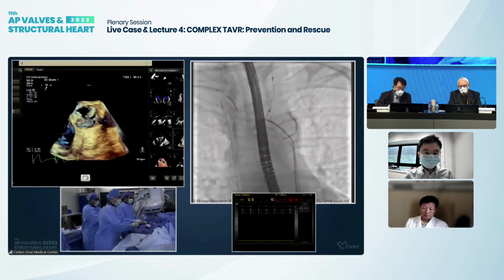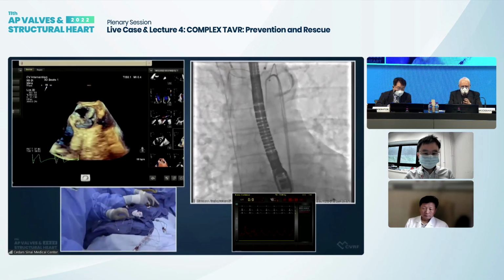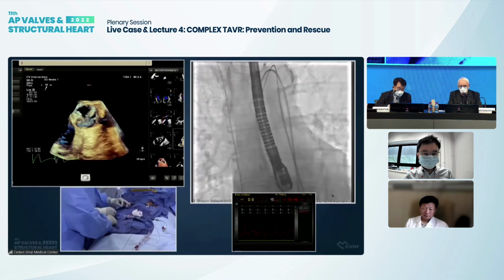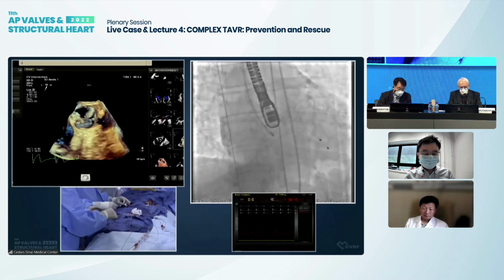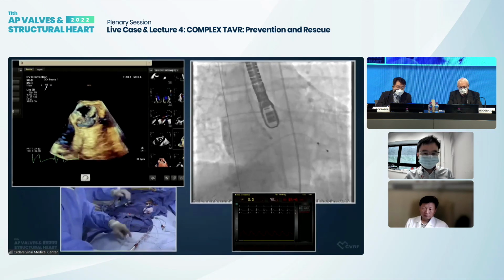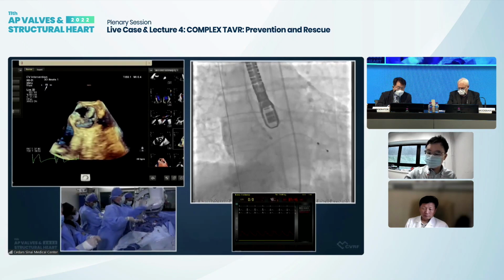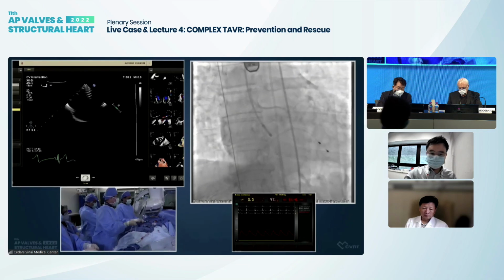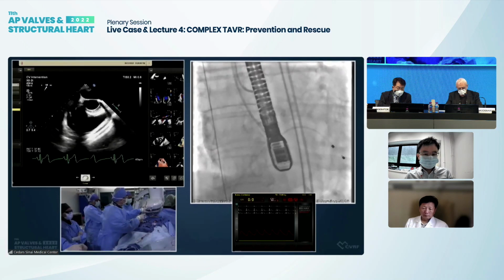Yeah. We had a nice lecture yesterday from David, and as you well know, he's awaiting these results that we all are. But he identified 2 patient groups, Jamie, that are at risk, which is bicuspid and valve-in-valve. So very well indicated here. Yeah. Now, Eberhard, I know that you've done all the pioneering work with the self-expanding valves.